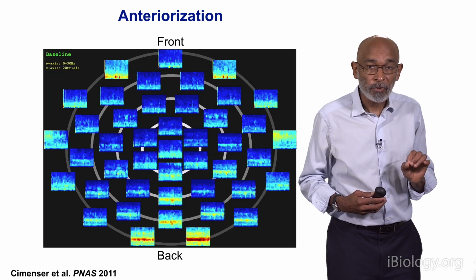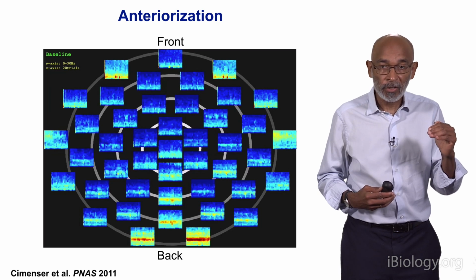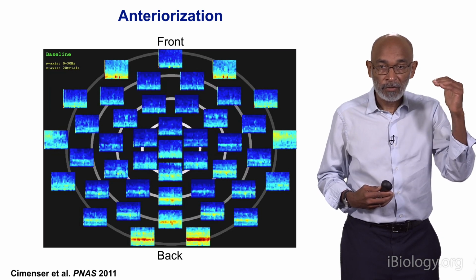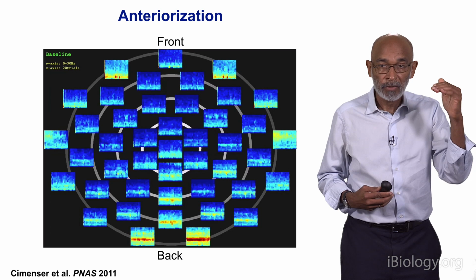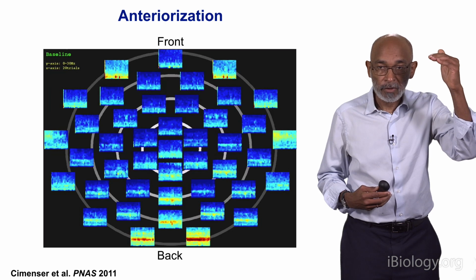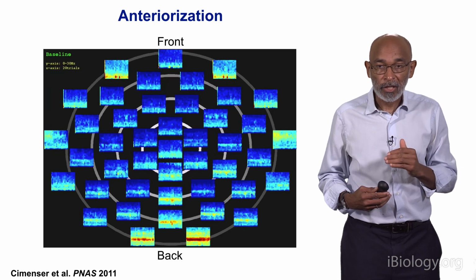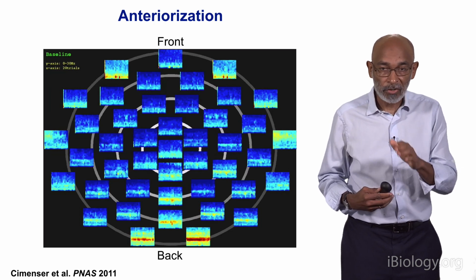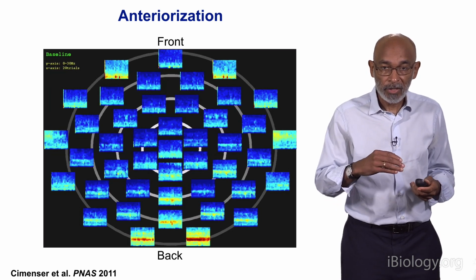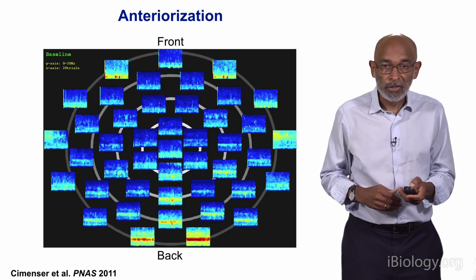So we're going to do a controlled experiment here. This is a volunteer subject. We're going to give him increasing doses of propofol. We're going to increase the dose roughly every 14 minutes or so, up to a level where he should be profoundly unconscious. Then we're going to back it down. So it's going to take about a little over an hour for him to reach the highest point, and then it'll take about another hour for him to come down. So this is going to be a little over 2 hours, what I'm going to show you in just this compressed video here. And you're going to see this alpha oscillation move from the back of his head to the front. When we turn the drugs off, it's going to move backwards. So I'm going to play this now.